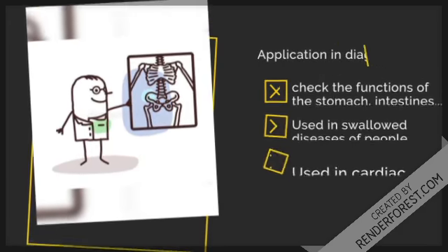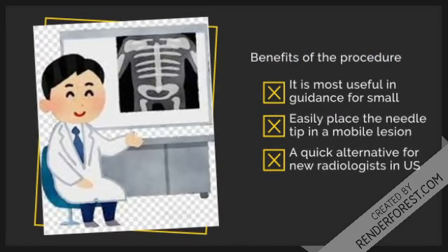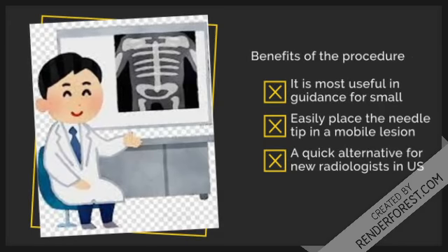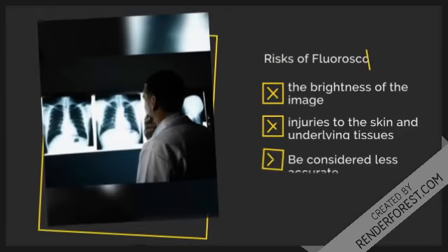In cardiac procedures, dye can be injected into the coronary arteries to show blood flow or to investigate potential blockages. Catheters may be placed more easily due to fluoroscopic guidance. Several spine and joint injections can accurately be made using fluoroscopy after dye is injected.